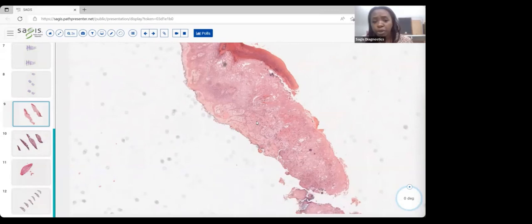Okay, so ORF, we get some help. ORF is typically going to be acral. It's usually through direct inoculation to people who have some contact with animals like sheep or the pastures that they live in. So it's a very characteristic infection, and there has to be that opportunity for an animal contact. Okay, so that's also very helpful. Let's move on to the next diagnosis here.